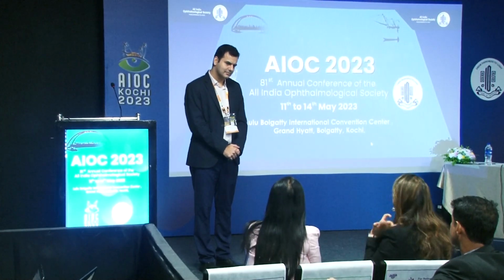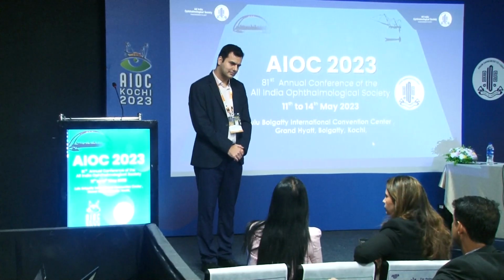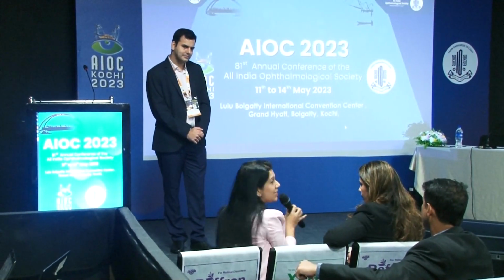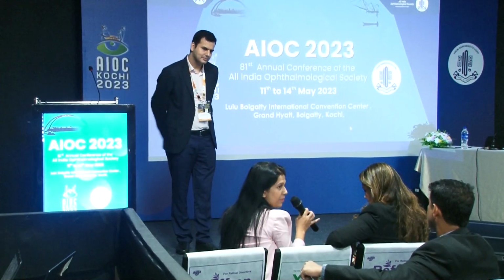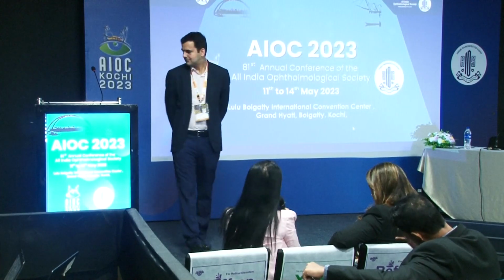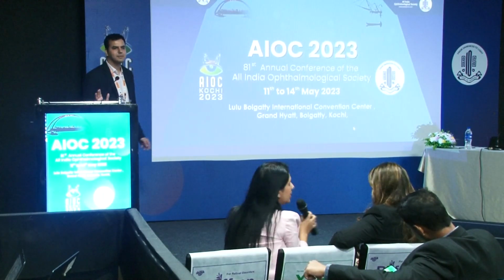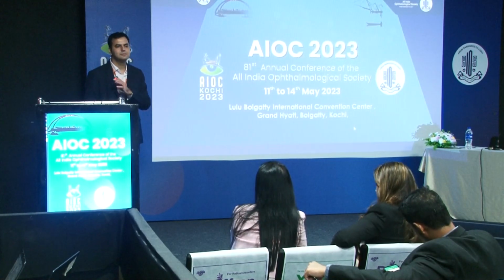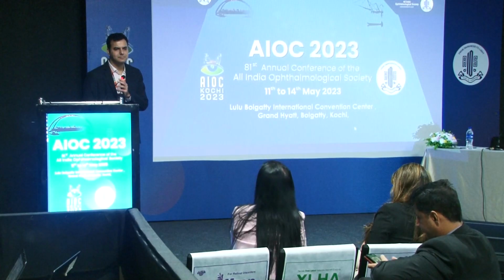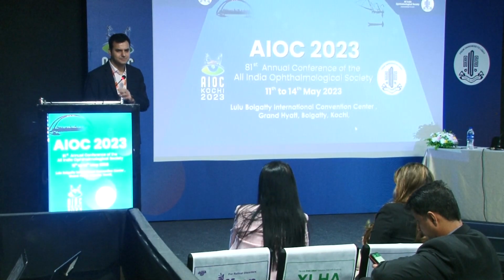She was expecting, and I think this was the patient that had post-operative inflammation after the ICL. She had an unexplained TASS reaction in one eye after the ICL implantation, and about 2 years down the line she came to me with a cataract, and it needed to be operated. The patient was very motivated for a trifocal lens because she was in the young age group. She was not willing to wear a full near addition.